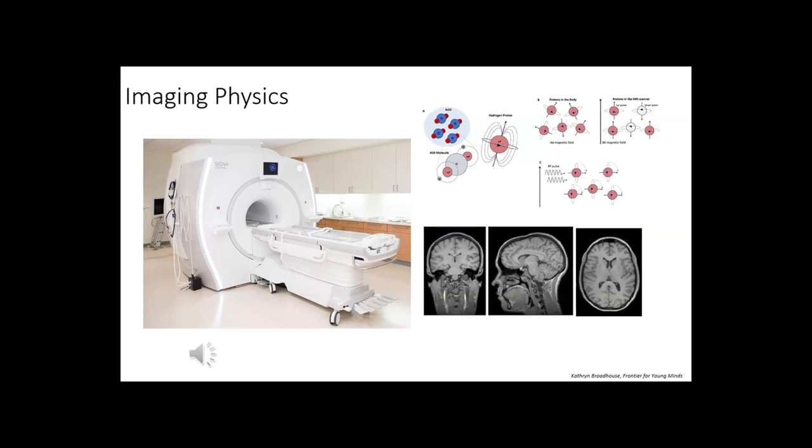All the molecules we flip, some take much longer to go back to the original status, so that is why we see the contrast. This is very bright, basically assumed to have only a small amount of water molecules, and this black has a lot of molecules. Also here is the ventricle, which is also connected to the spine, so we see it as dark.